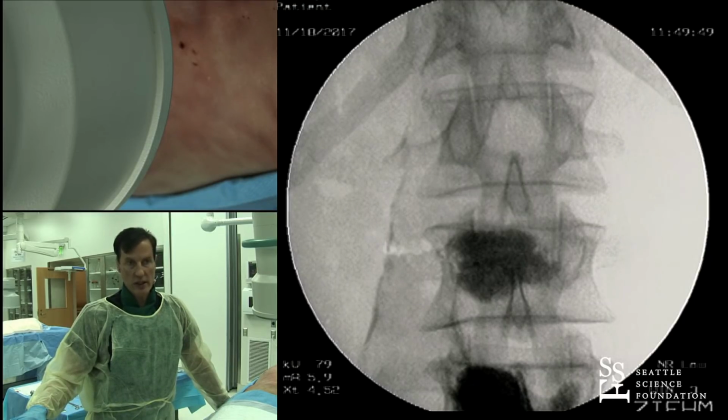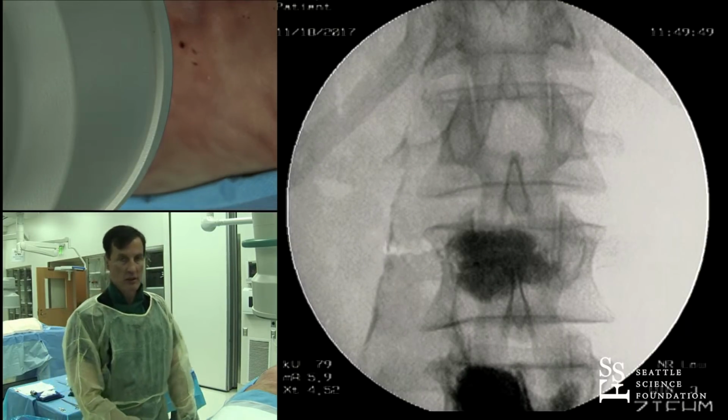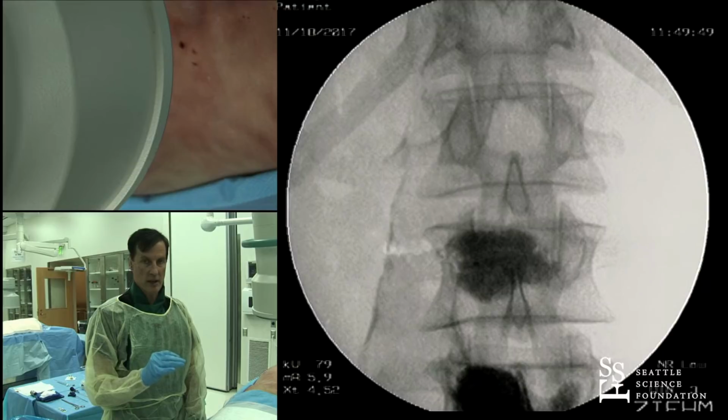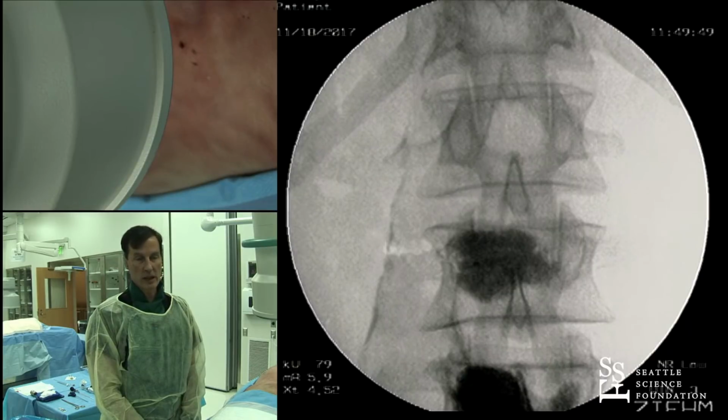This will be the single modifiable thing that you can do that will give you better results in terms of greater pain relief and greater duration of pain relief. Given that this is a single modifiable thing that makes a difference in duration and amount of pain relief, the most common error that I see people make is not enough cement, because they're afraid of extravasation. So sharpen your eye and look for extravasation.